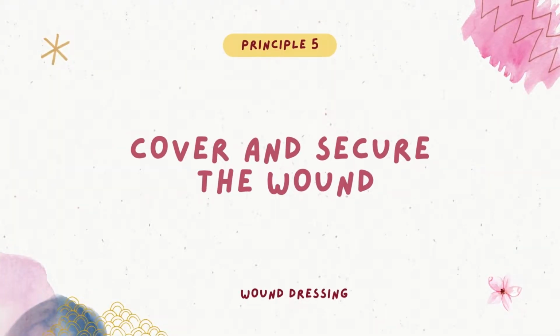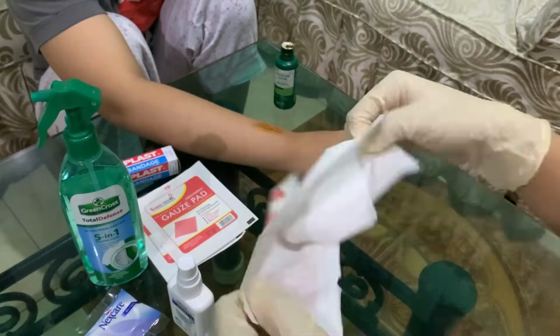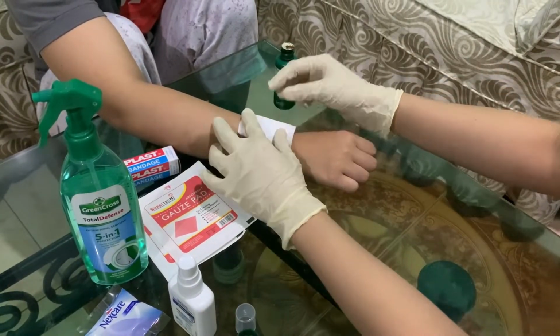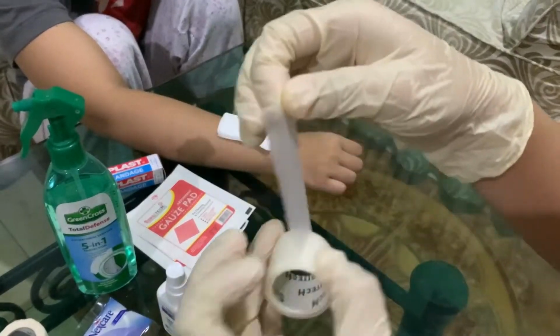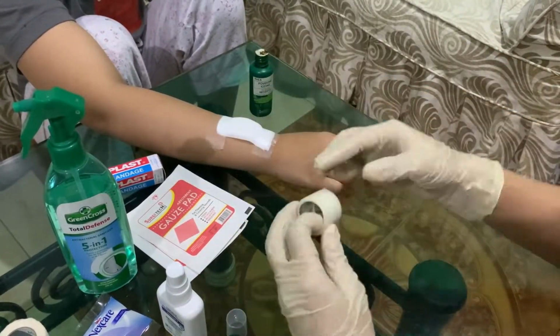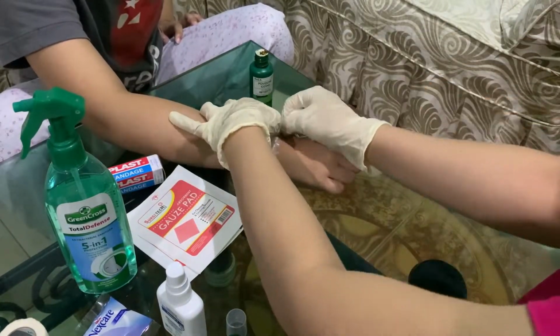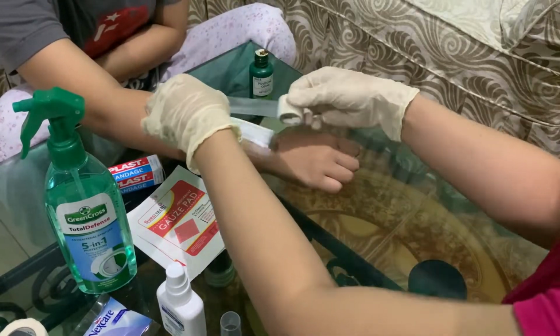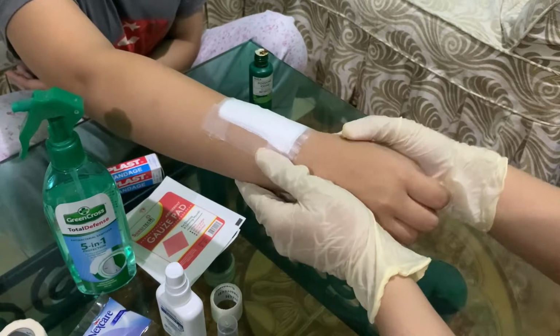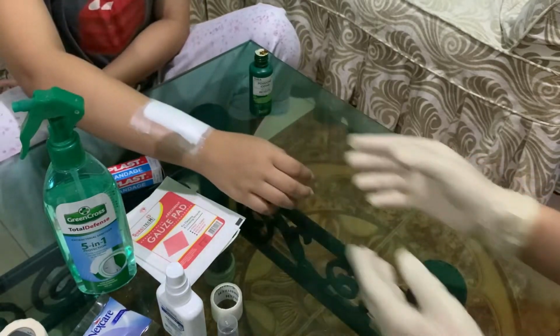Lastly is to cover and secure the wound. Here, you are going to use a gauze pad or any gauze to protect the wound from debris or dirt and other factors. Make sure that the gauze is not too small or big but just fits perfectly for the wound. Use medical tapes like transpore, micropore, or cloth tape to prevent the gauze from falling. Make sure that the tape is not too tight that it suffocates the area but rather just sticks snugly to hold the cover in place.